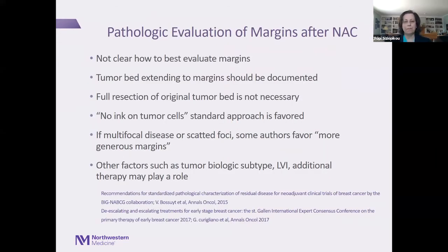Now, what about the margins? What do we do about that? Well, unfortunately, no clear guidelines exist on how to best evaluate margins post-neoadjuvant chemotherapy. Full resection of the tumor bed is not necessary. However, if the tumor bed extends to the margins, we should mention that. That should be documented. The standard approach of no ink on tumor cells is favored.